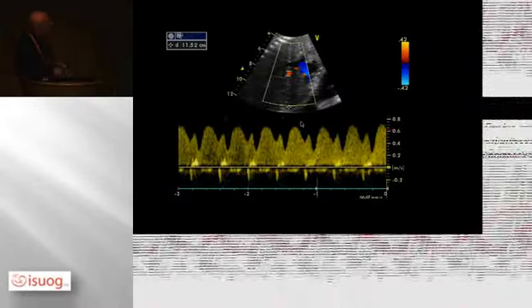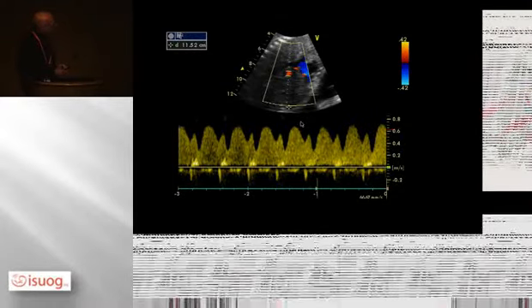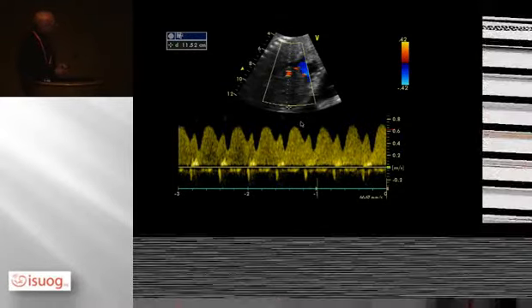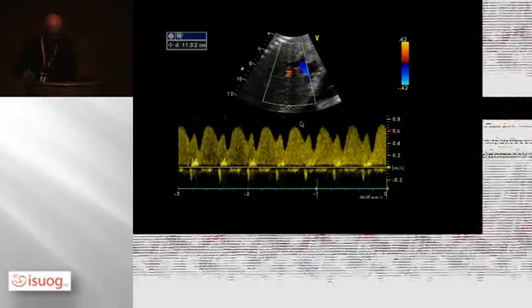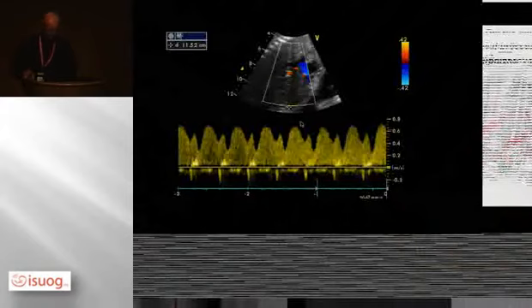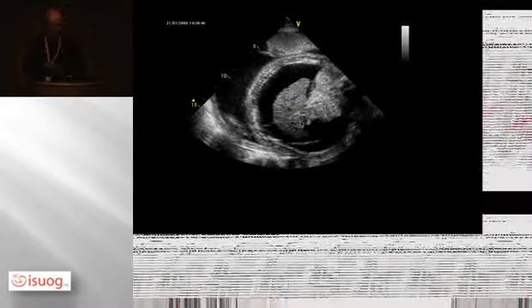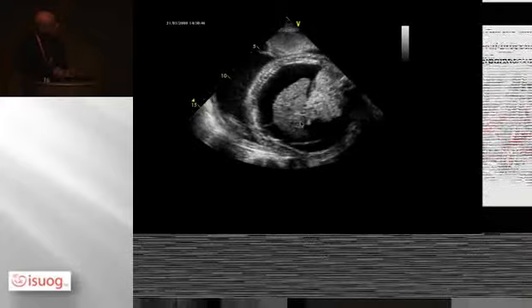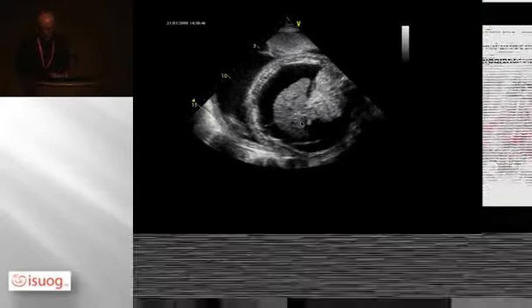So now we are back to this insonation. We got an accurate angle, and we can measure the velocity here. And this velocity is directly connected to pressure through the Bernoulli equation. Let me take an example for you. This is a growth-restricted fetus originally, but it's more than growth-restricted, as you see. There is an ascites. Why?